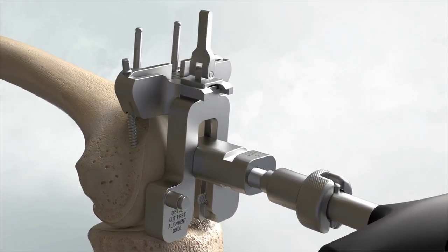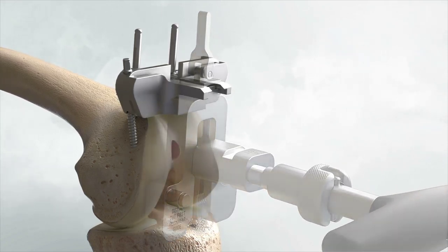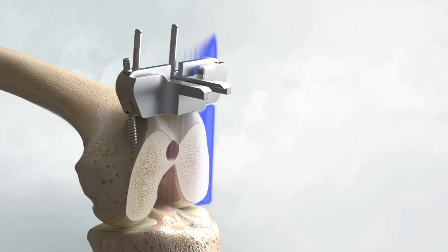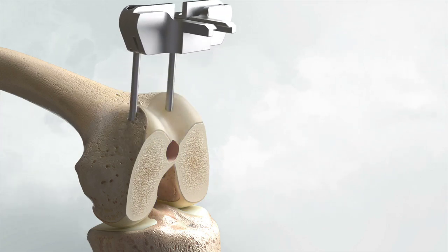Unlock the lever on the valgus alignment guide. Remove the intramedullary rod and the valgus alignment assembly using the universal extractor. Only the distal femoral cutting block should remain on the femur. Resect the distal femur, then remove the distal femoral cutting block but leave the two parallel pins in position.